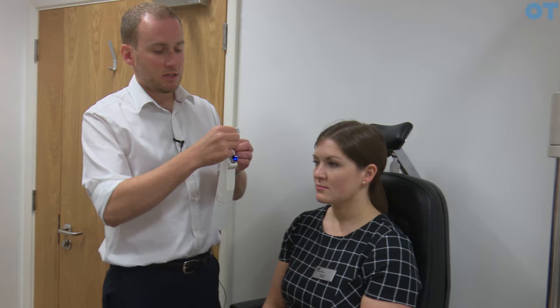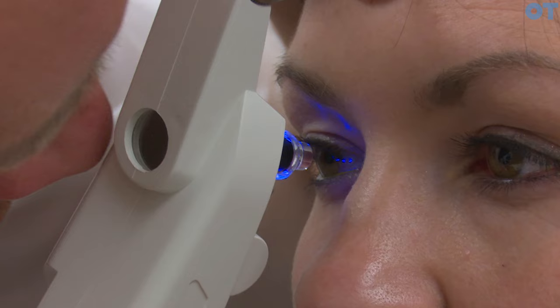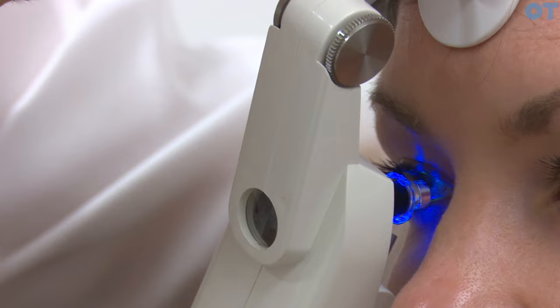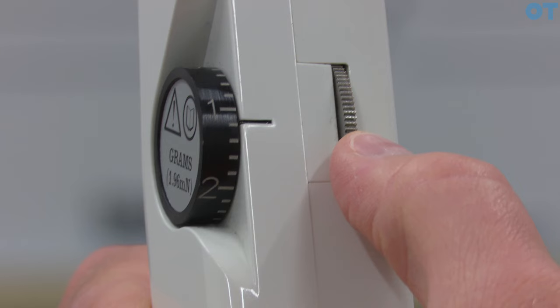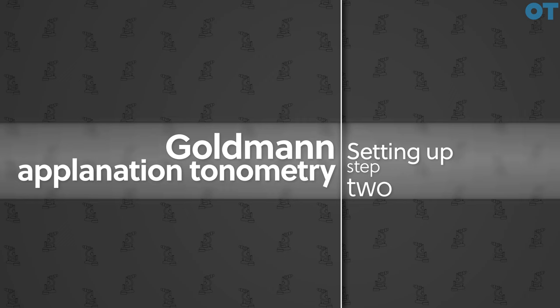We ask the patient to look straight ahead and introduce the headrest, pulling it out and locking it off. That's placed on the patient's forehead, then we place our thumb on the instrument. Before contacting the cornea I stop to make sure I can lean down and see onto the patient's eye, then move my head and introduce the probe onto the eye. You can see that the probe starts to glow. As we do that we look back down, rotate the dial until we get the optimum position, and then remove the instrument. We multiply whatever we measure by 10 to give us the pressure of the eye in millimetres of mercury.